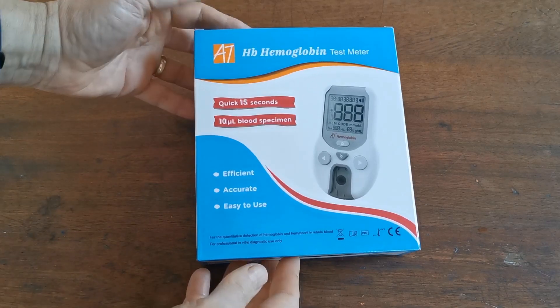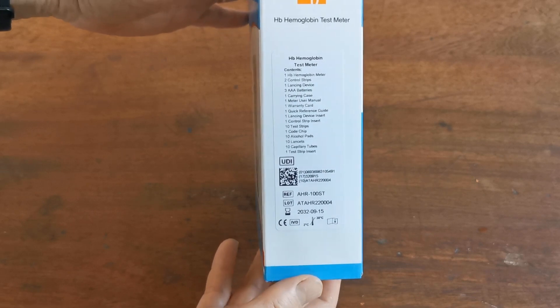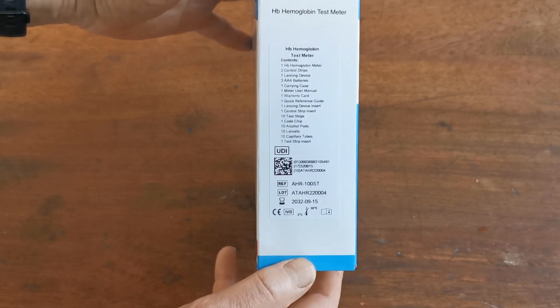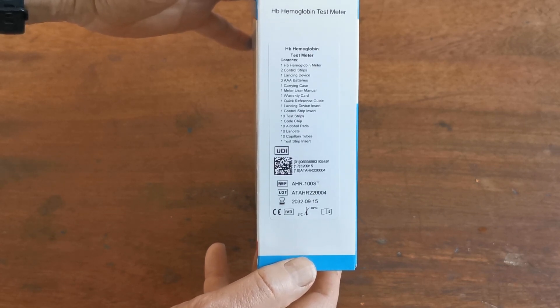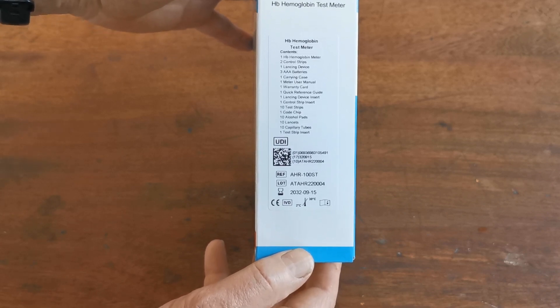This is the test meter starter pack. As it comes boxed to you, you'll see that the contents of this pack include the meter, control strips, lancing device, batteries, carry case, user manual, warranty card, quick reference guide, lancing device inserts, and control step inserts.